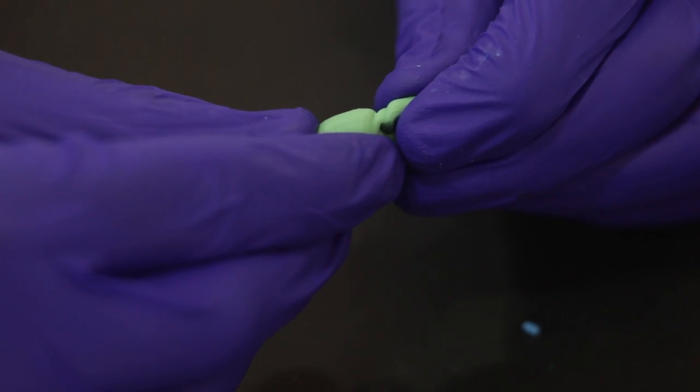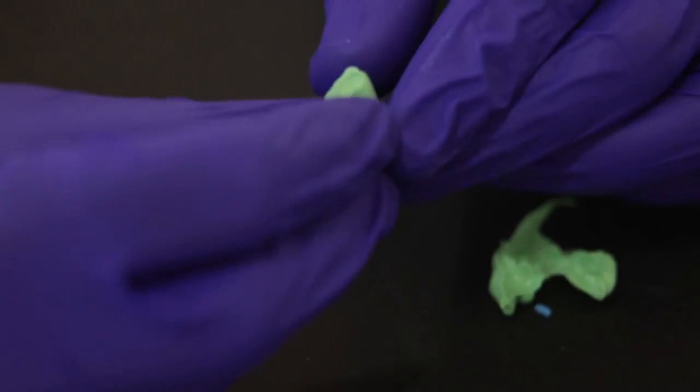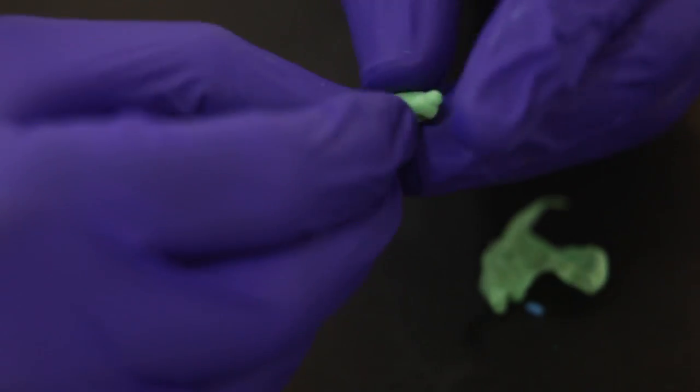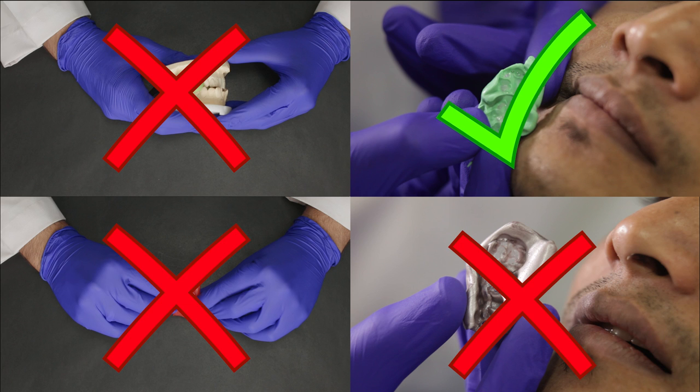A test to see how rigid the material is is to try and break the set material. It should break off very cleanly like a piece of chalk. So next time when a dealer walks into your clinic with a VPS bite, don't let him fool you — do this quick test yourself. I would strongly recommend the use of VPS bite materials for crown and bridge dentistry to have greater predictability and more accuracy.